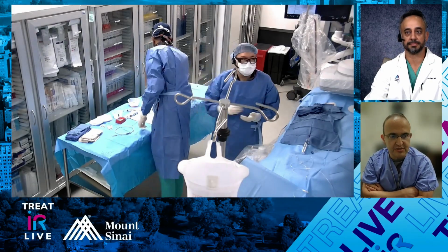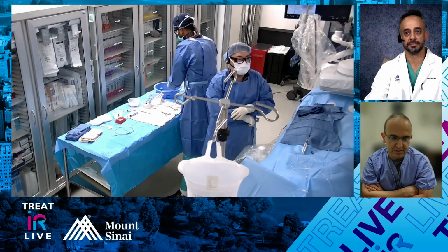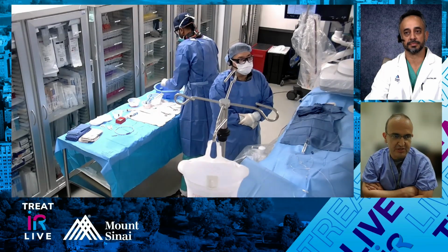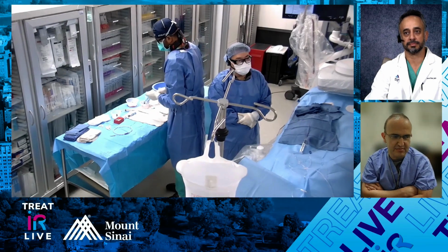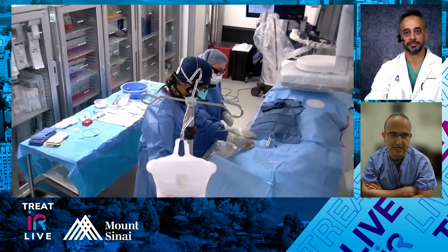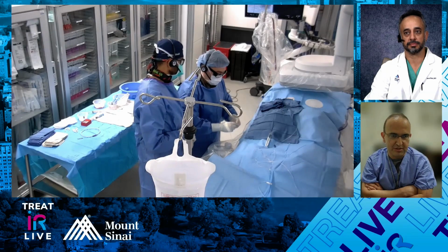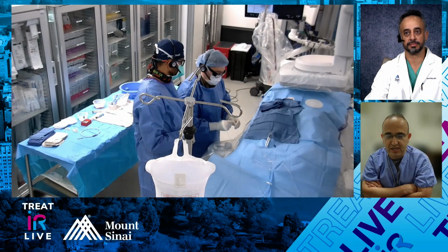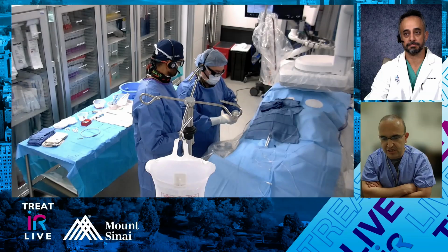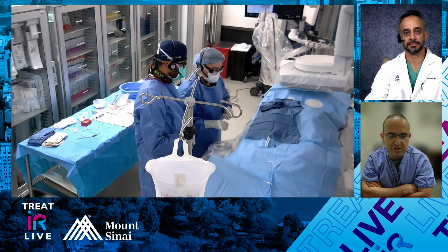Thanks for having me. Yeah, like you said, we get a lot of referrals from our hepatologists because these patients have a high prevalence and portal hypertension. I think the guidelines say up to 15% of patients with cirrhosis and portal hypertension have these, and they recommend the 2-centimeter cutoff. Our guys especially like us to treat them if they're going to transplant, because they don't want any surprises in the OR. They like us to get at them, just like you guys are doing.